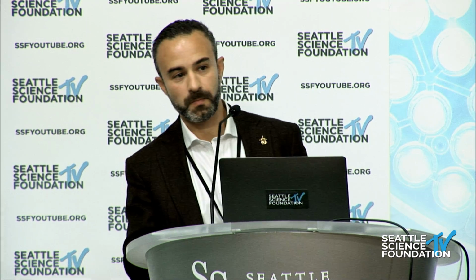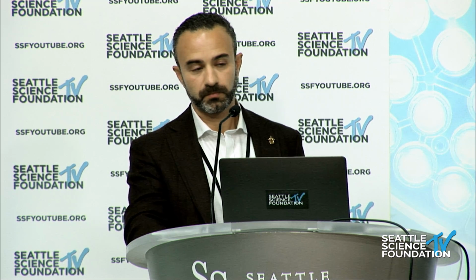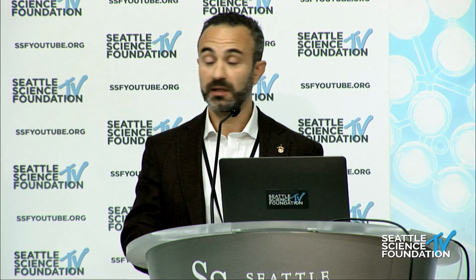So you're sticking with Hounsfield units up at the UIV, UIV +1, and less so down at L4, L5, where you're doing those big ALIFs. Yes, generally, I'm less worried about that sclerotic portion at the lower part. But again, there are some patients that are very osteoporotic, so not that we're ignoring it, but I'm much more worried about the upper end of the construct in a revision setting like this.